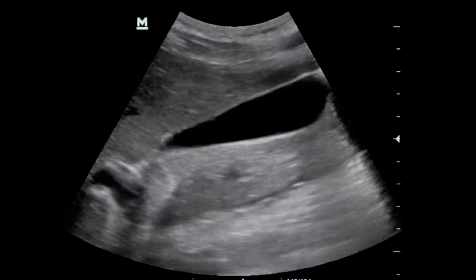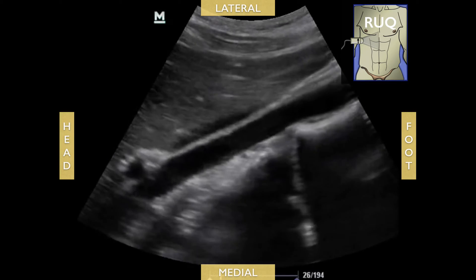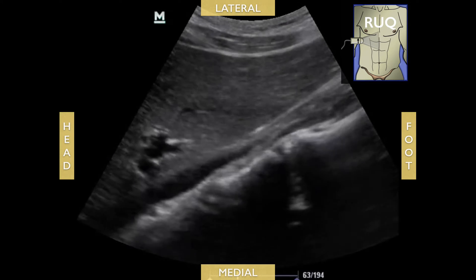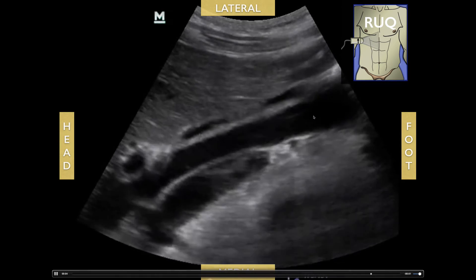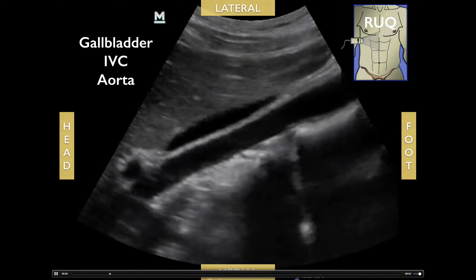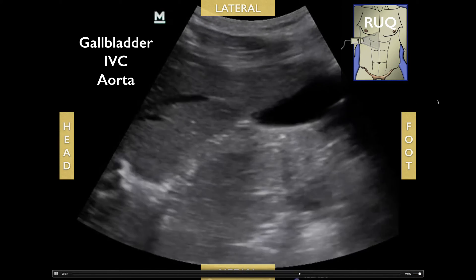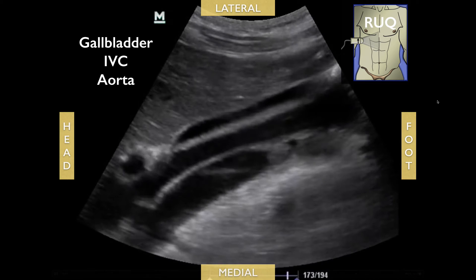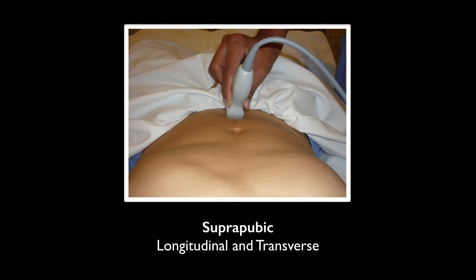Here are examples of false positives — here's a gallbladder and here is the IVC. If you fan through the image you'll see the gallbladder, IVC, and aorta all in one view. Make sure when you're calling a positive exam that you're looking at the correct structures.